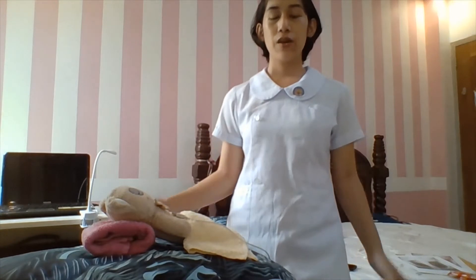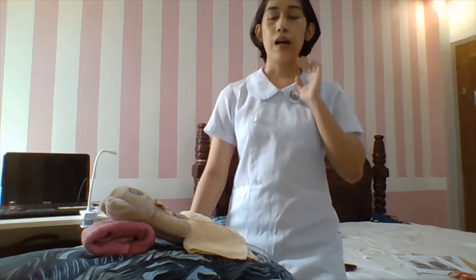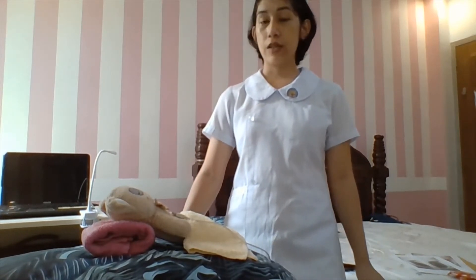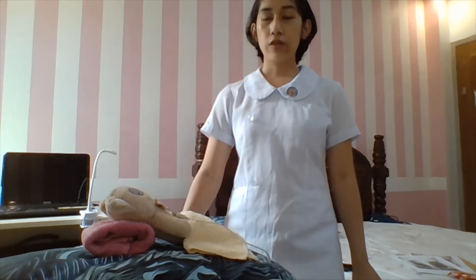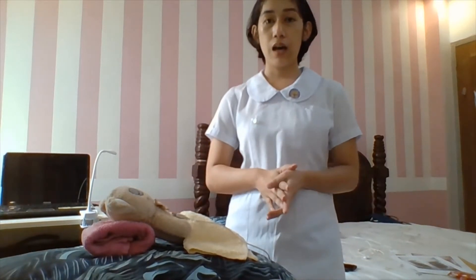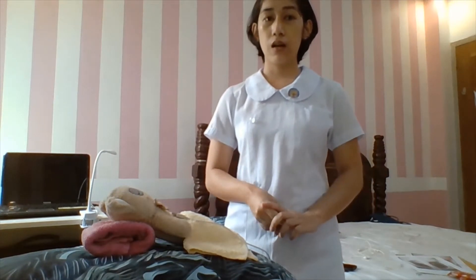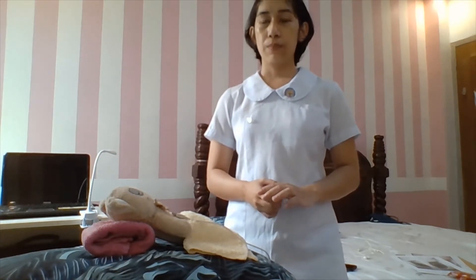Good day. In today's demo, we are going to demonstrate the electrocardiogram. This procedure allows nurses to identify disturbances in the patient's cardiac status, monitor the effects of medication, give information about the size of the heart chambers, and aids in diagnosing complications such as myocardial infarction and pericarditis.